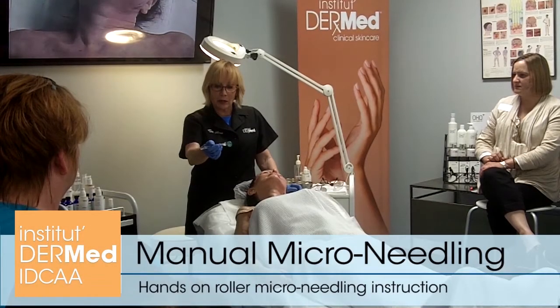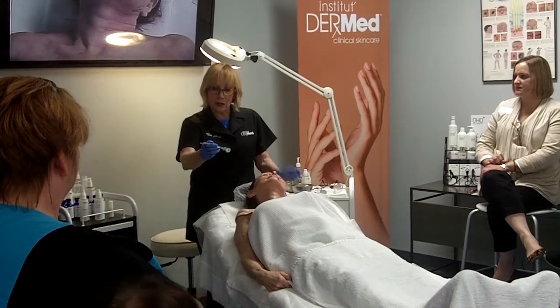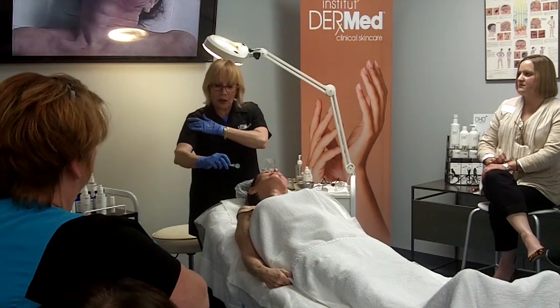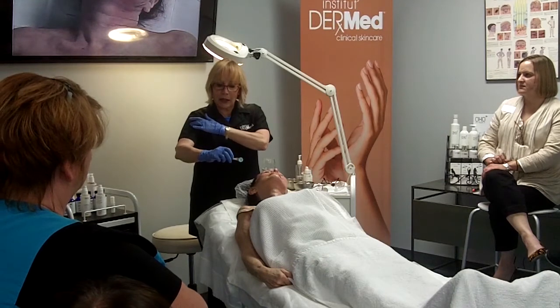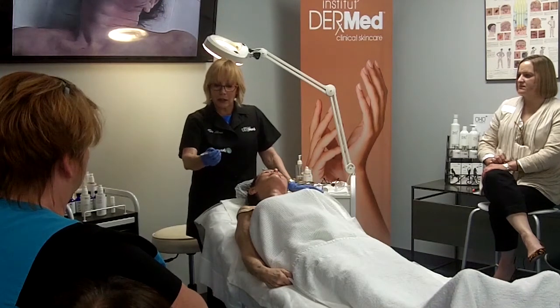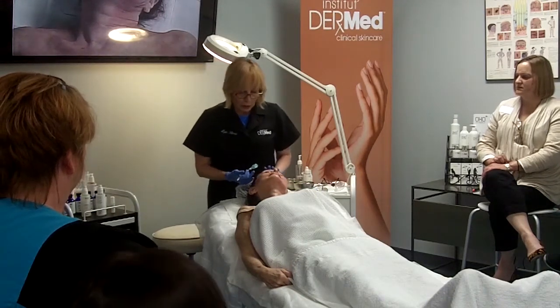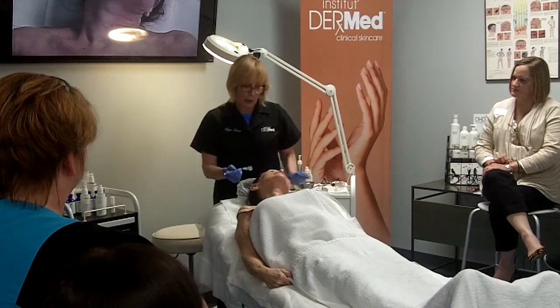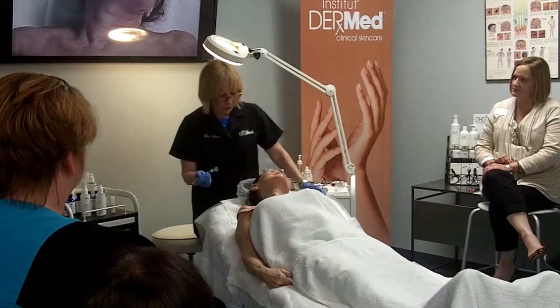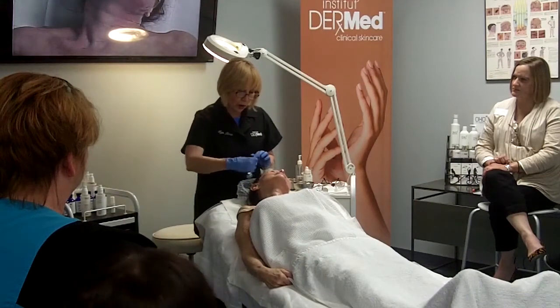When I put the barrel down, my wrist twists in a little bit, and that helps to give me some pressure on the barrel, on the needles. If I'm overhanded like this, now I've got to rely all on my shoulder to put the pressure on the barrel, and so I'm not going to get as efficient a treatment for my body. My body is actually going to like just a little bit of elbow and a little bit of wrist as opposed to all of my shoulder. So when you're using the rollers, it's more of a fast pace. Some people you see, they just go, that's just too painful. So I've got to do kind of the same pattern, the cross and the diagonal.